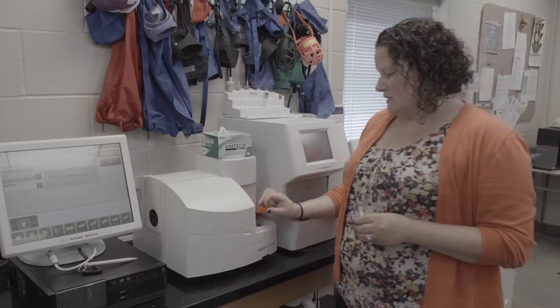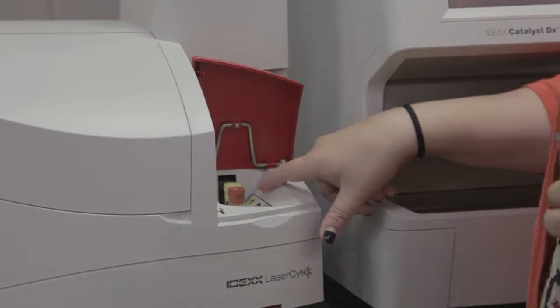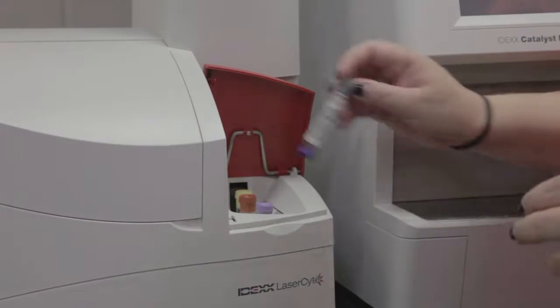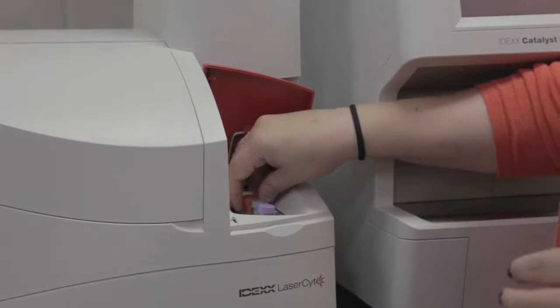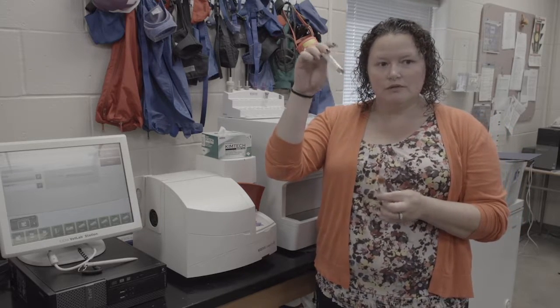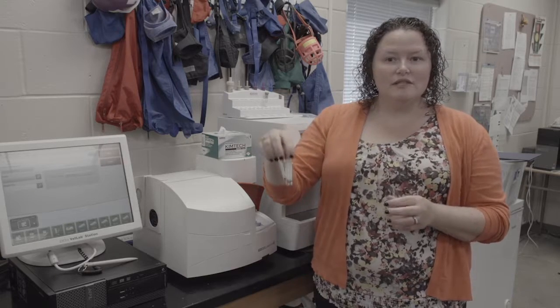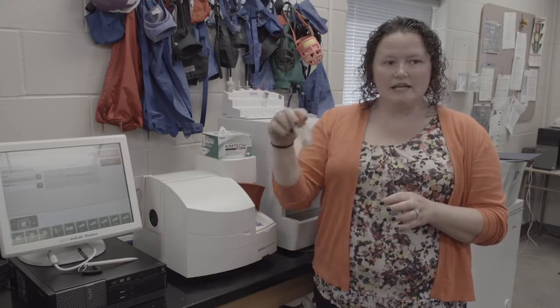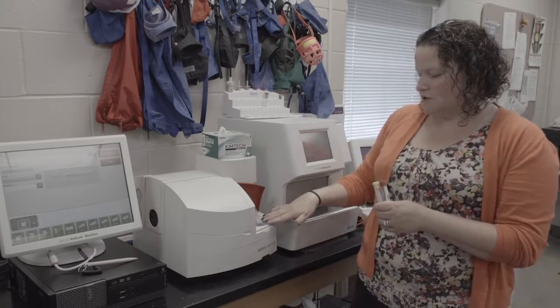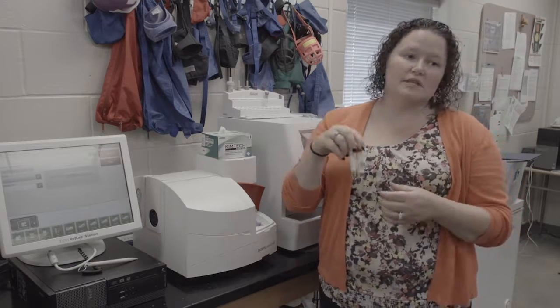Inside the analyzer itself, in our sample drawer, there are color-coded slots for each of the tubes. So there's a slot number 1 for the purple top tube and a slot number 2 for the gray top tube. And then in here also there are 2 other tubes. There is a yellow tube that's the cleaner tube, and then a red tube that is a waste tube. These live in here and don't need to be taken out after each run. You would only replace these when you open up a new box of tubes. That'll come with a new set of these, and you put them in then. So that's the only time these get changed out.